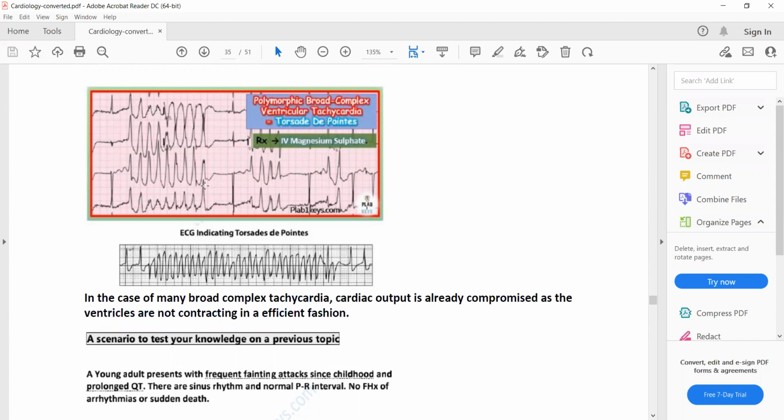In this part of the ECG strip, the person is having tachycardia, so it's not possible to calculate the QT interval directly. For these cases, we need to calculate a corrected QT interval, for which there is a specific complex mathematical formula, which is usually incorporated into the automatic ECG machine. So the QT interval is automatically calculated by the ECG machines, and it is given to you automatically.